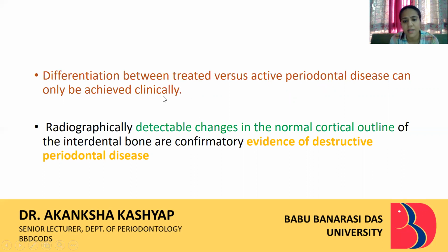But if we see a detectable amount of changes in the normal cortical outline of the radiograph, it definitely means that there is destructive periodontal disease.